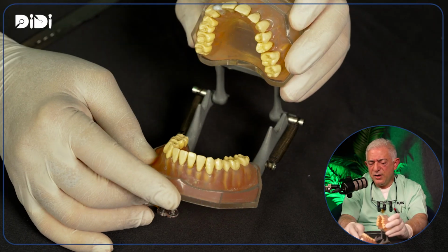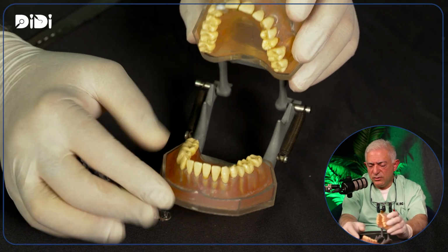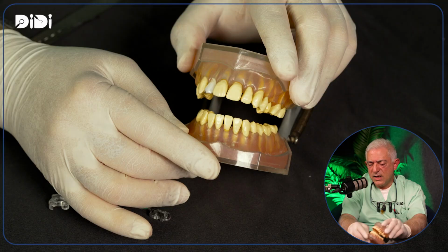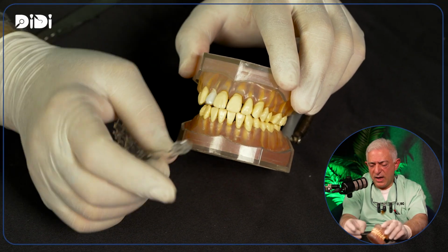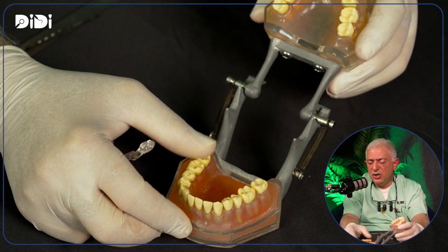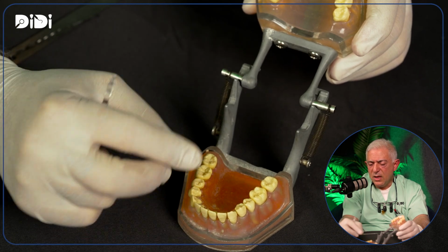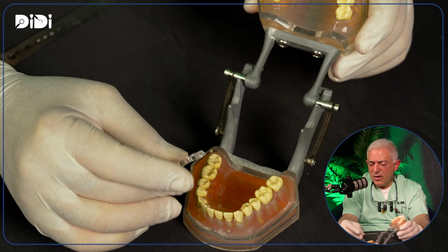Because the theory is you have to keep the patient in a new vertical dimension, which is not collapsed, and wait for 21 days or 45 days till the patient gets used to it. Now, we have a solution for that: you don't have to wait even 1 day. And the solution is the material which you are going to place on top of the teeth or make the crown or the veneer. It's either zirconia or Emax ceramic.